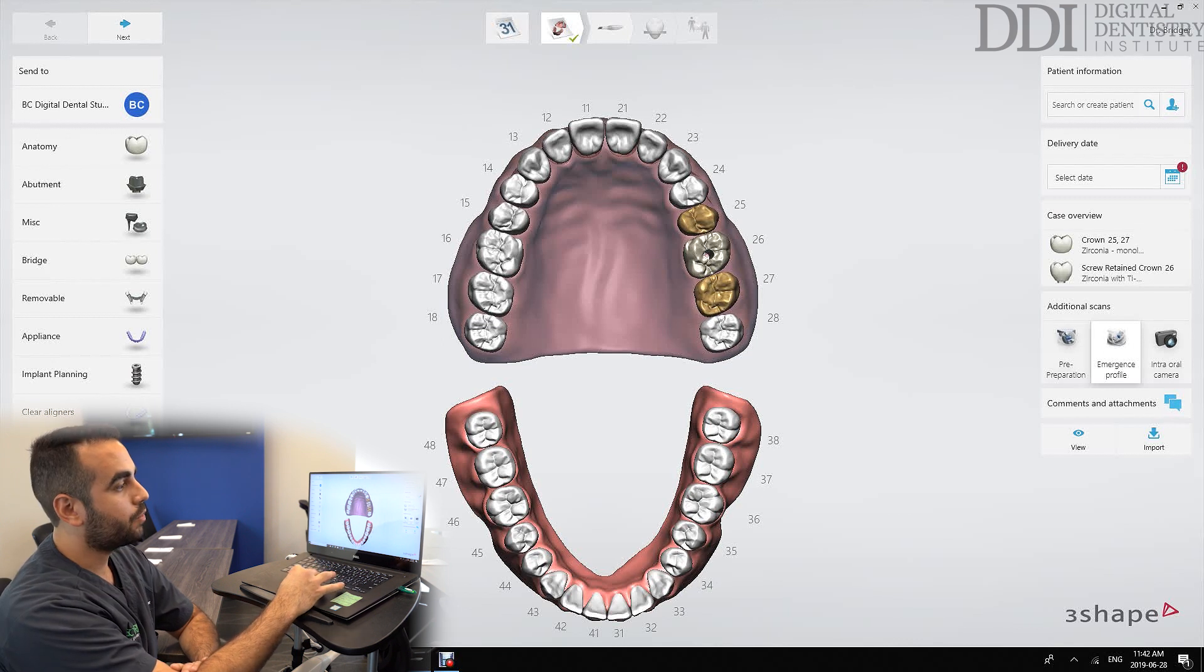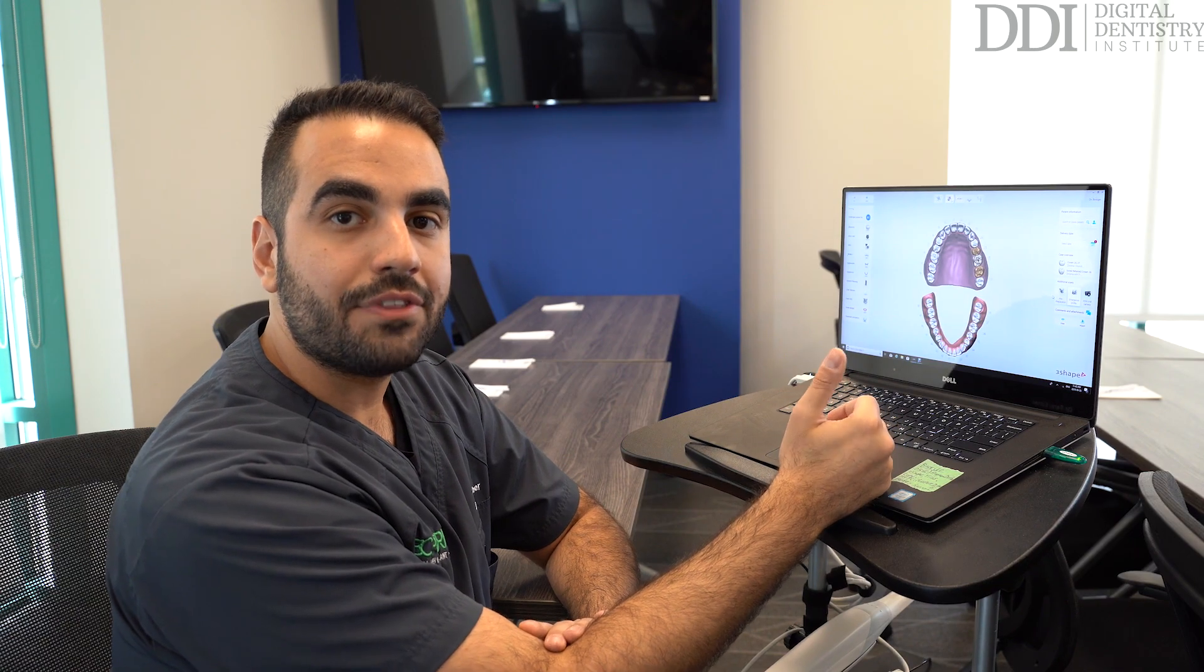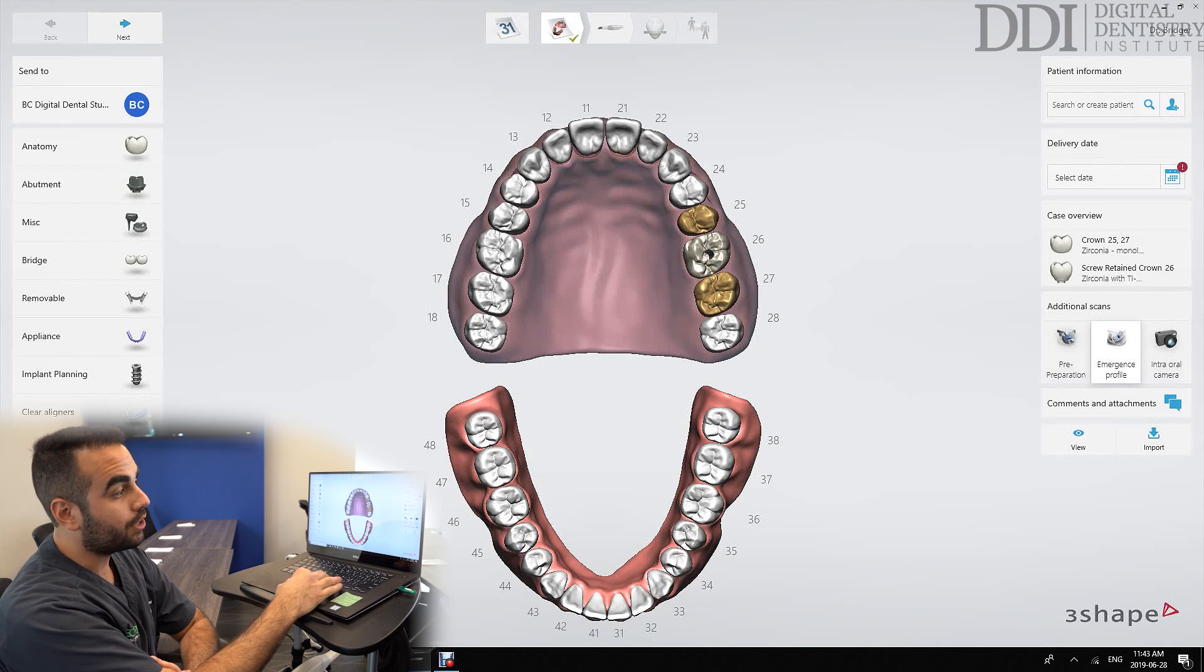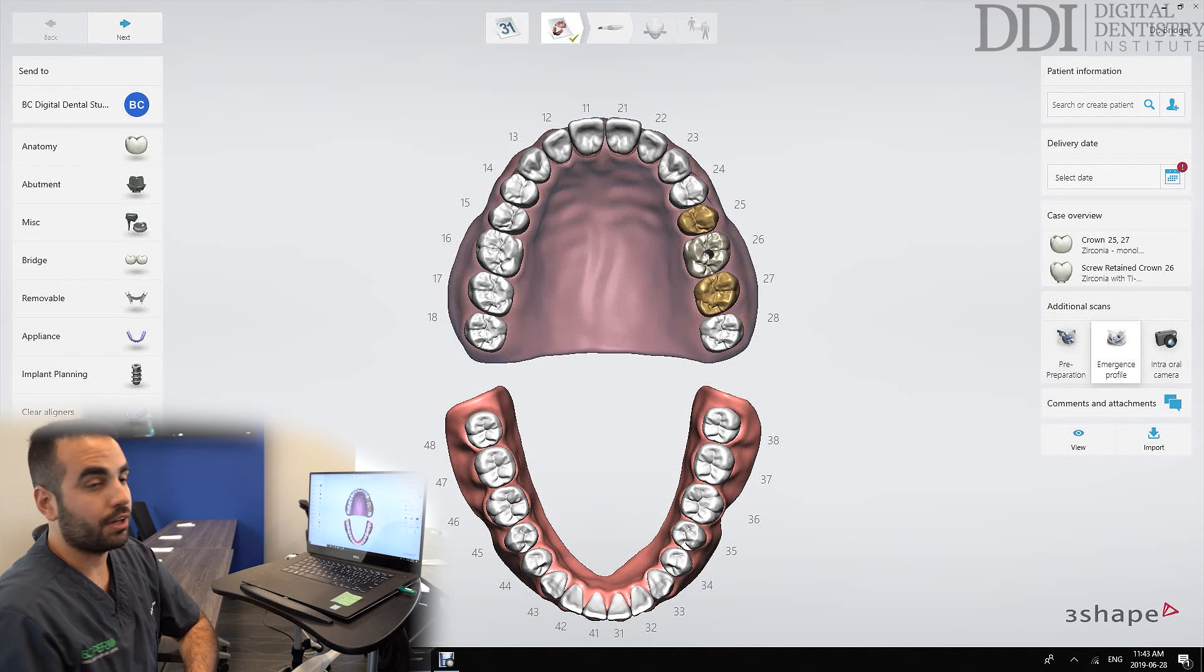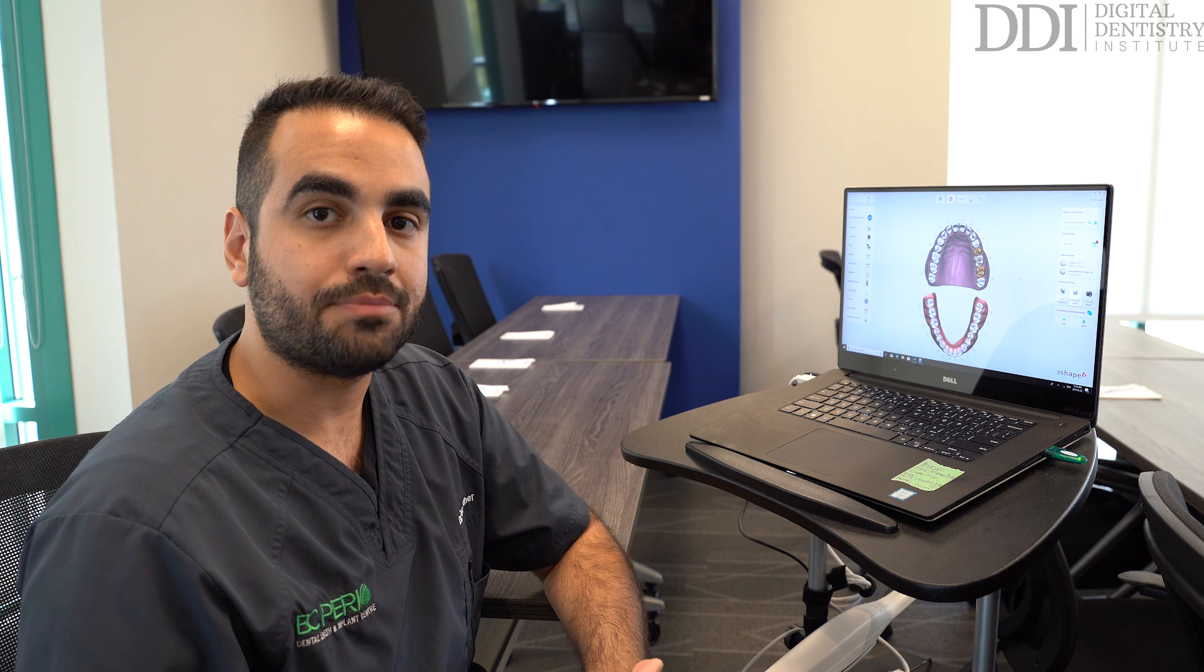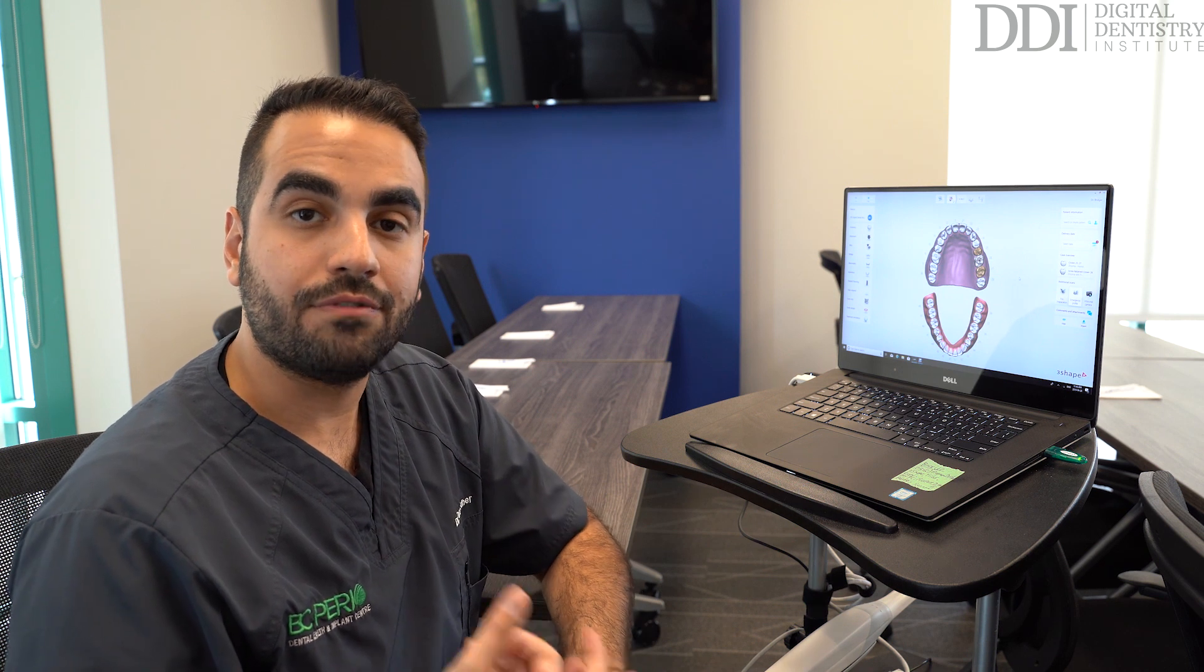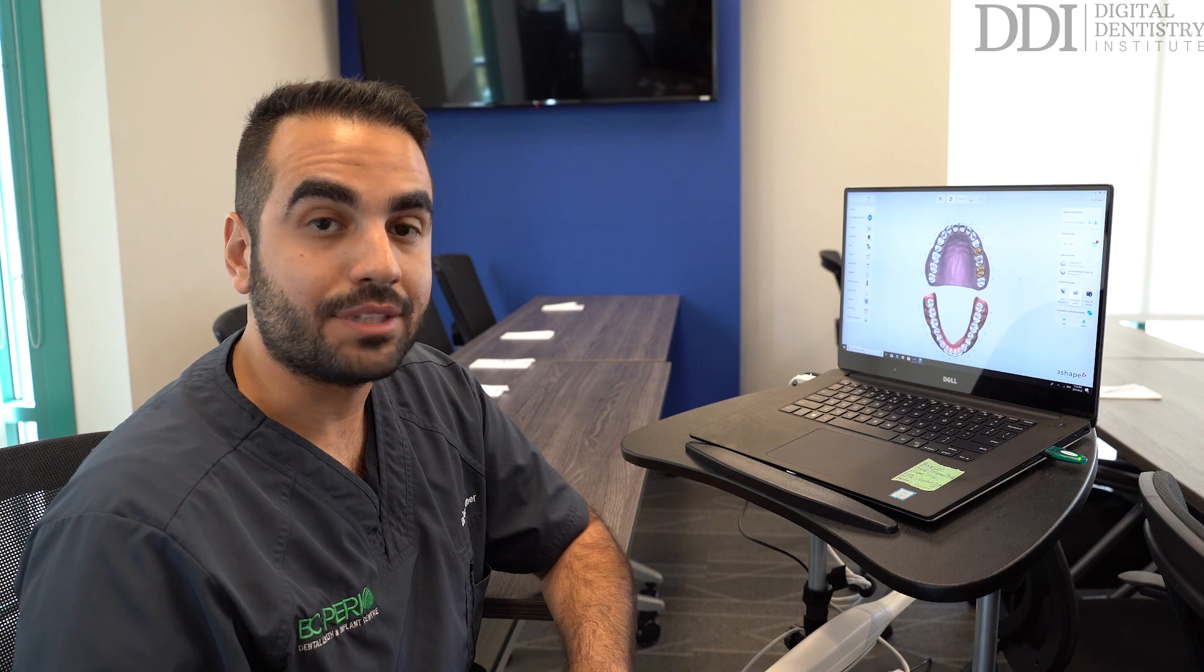Right under here we have the additional scans. These are very useful in some of these implant cases. In these additional scans there's the emergence profile option. We're going to select the emergence profile option to allow us to record the emergence that we've already established in the patient's mouth whether that's using a provisional crown or using a custom or standard healing abutment.